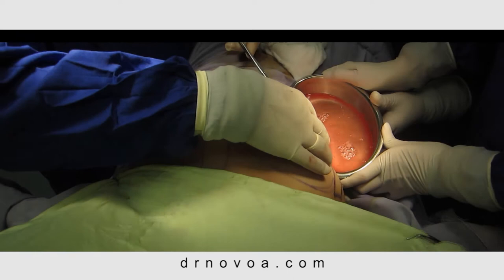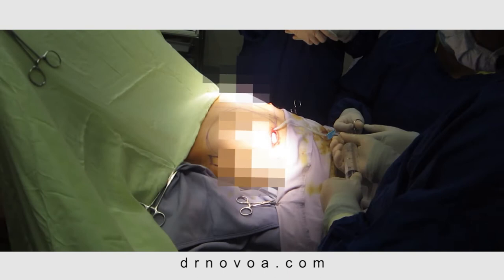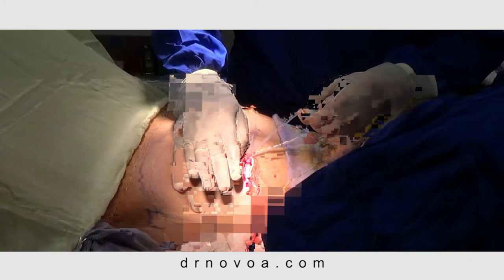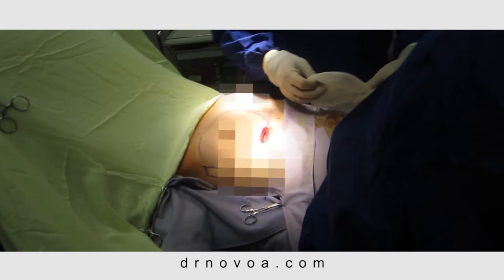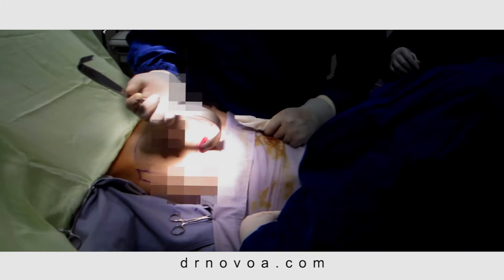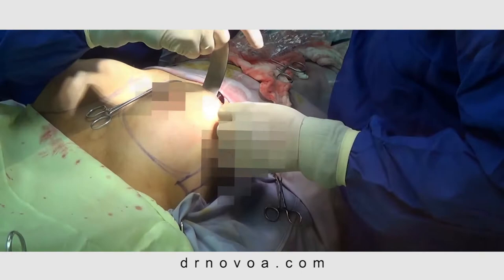An implant sizer is inserted, and the pocket boundaries are determined. A larger sizer is exchanged based on the estimated pocket capacity and inflated. The pocket is then irrigated, and the supporting sutures are then placed. Based on the capacity of the implant sizers, style 45 600cc implants are chosen and then inserted. The incisions are then closed using absorbable suture.